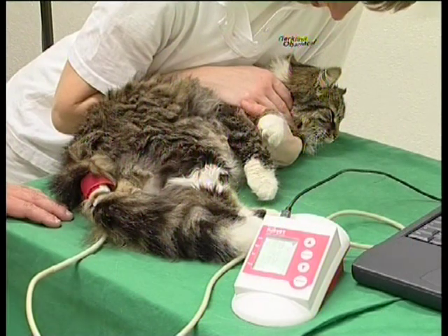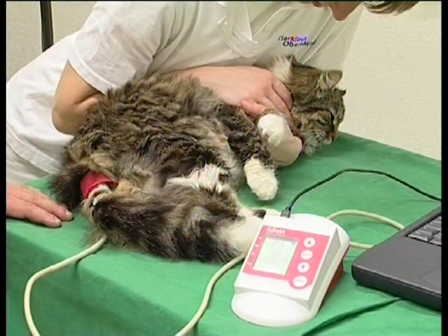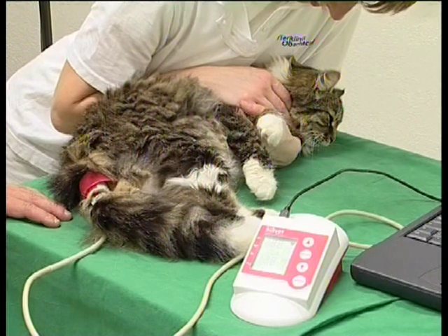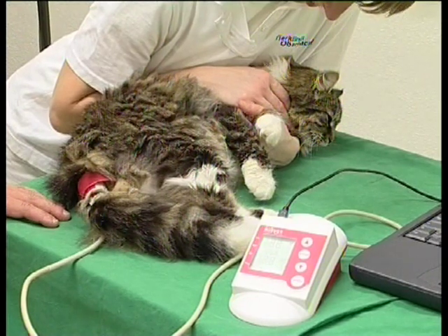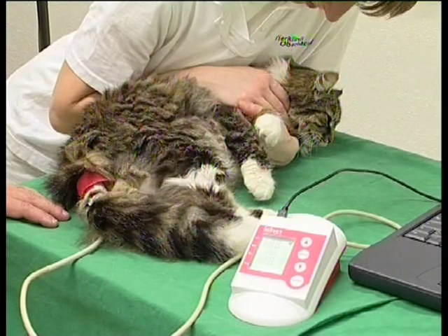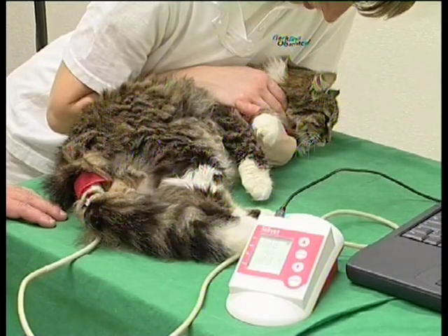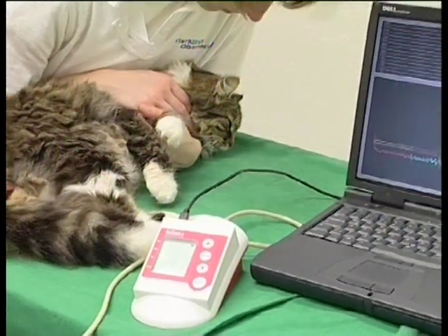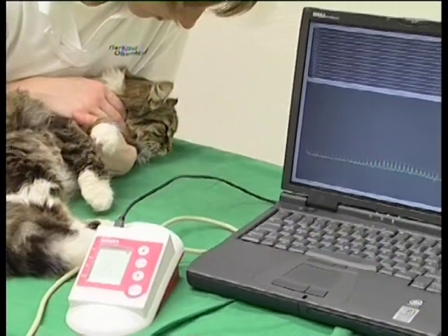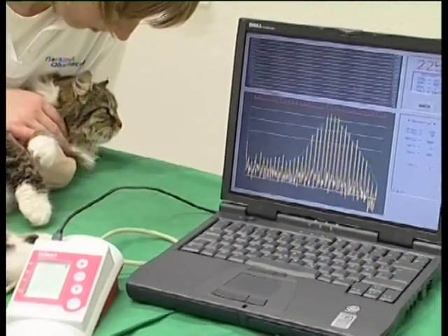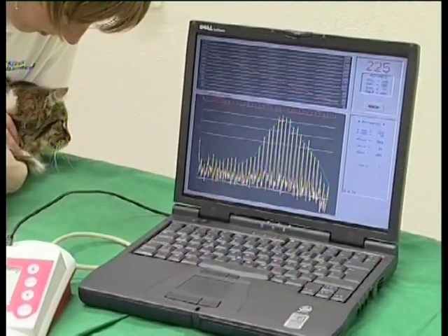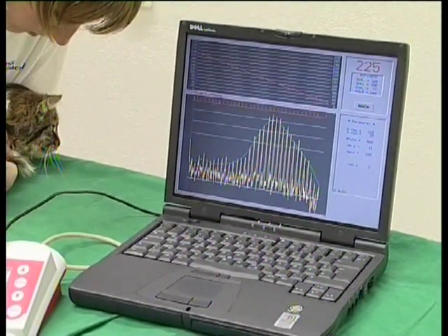To avoid such artifacts, it's easier and even more relaxed for a cat to be measured at the base of the tail, as shown before on the dog. The graphic of the measurement shows a perfect trace without any artifacts.